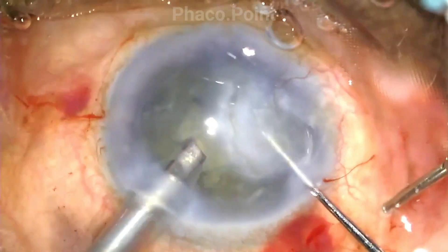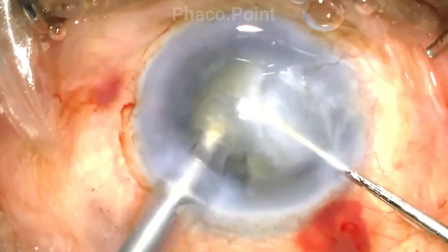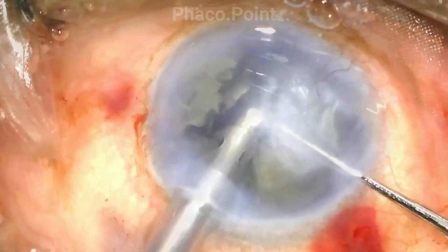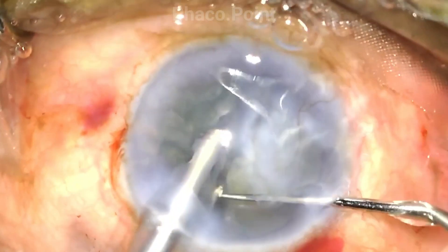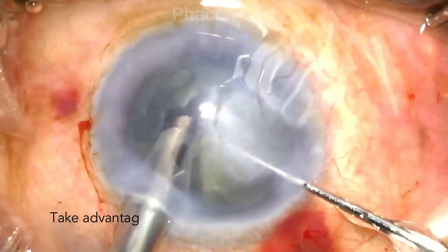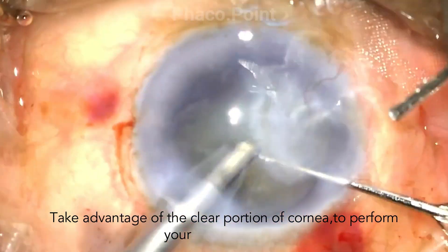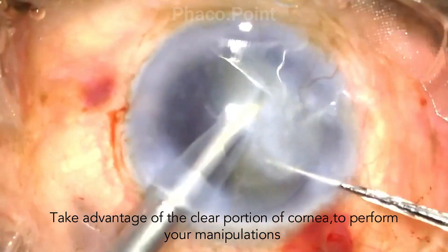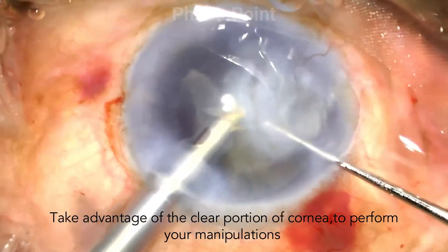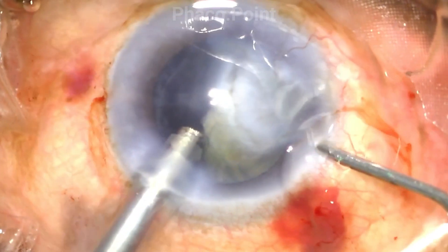In this part of the video you will watch how I perform the emulsification of the individual fragments. Please note, as explained earlier, how I take advantage of the clear area of the cornea and try to perform most of my steps there under direct visualization.